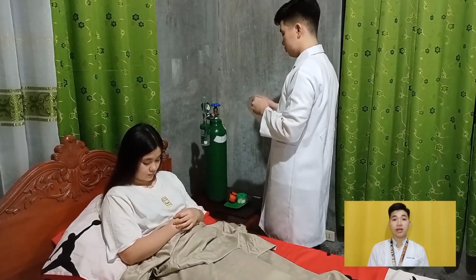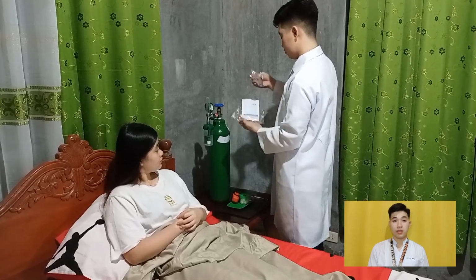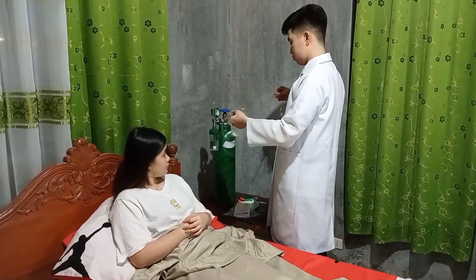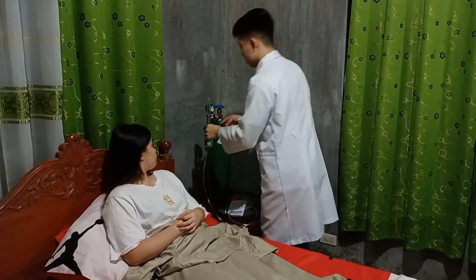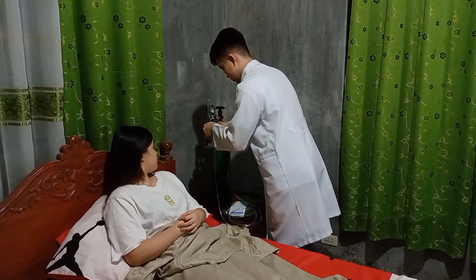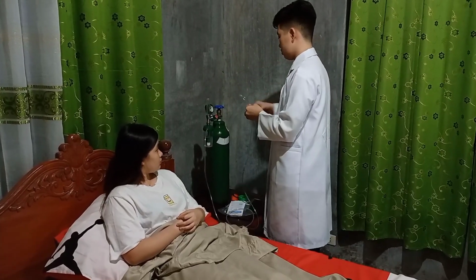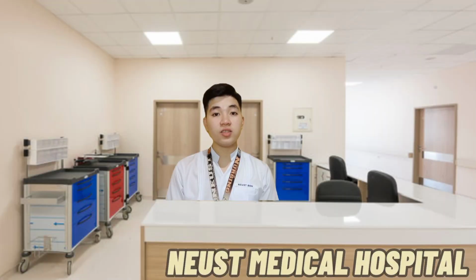Connect nasal cannula to oxygen setup with humidification if one is in use. Adjust flow rate as ordered. Check that oxygen is flowing out of prongs. Checking flow before use is needed to provide prescribed oxygen to the client.